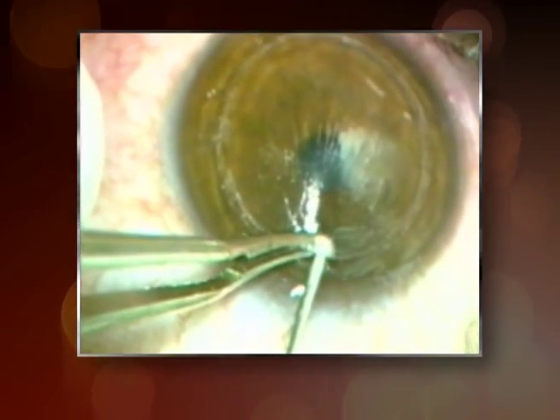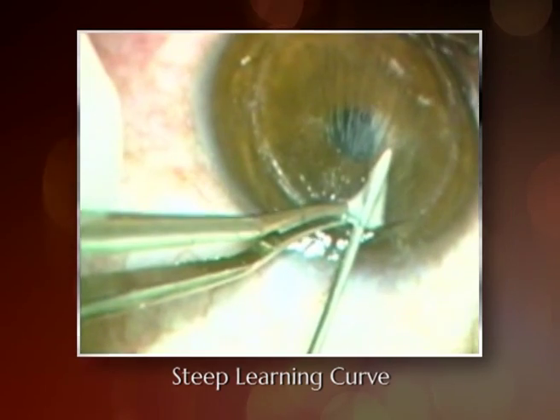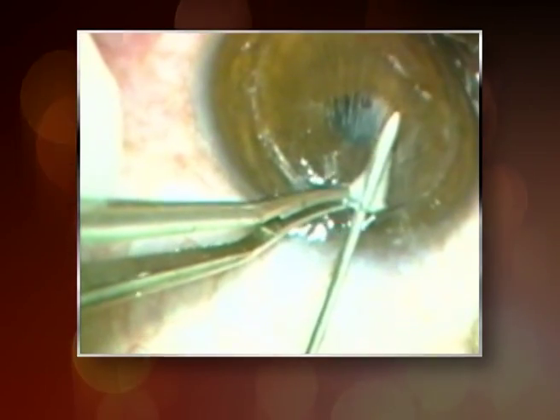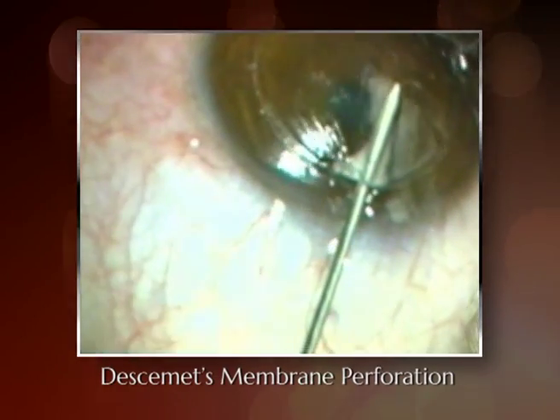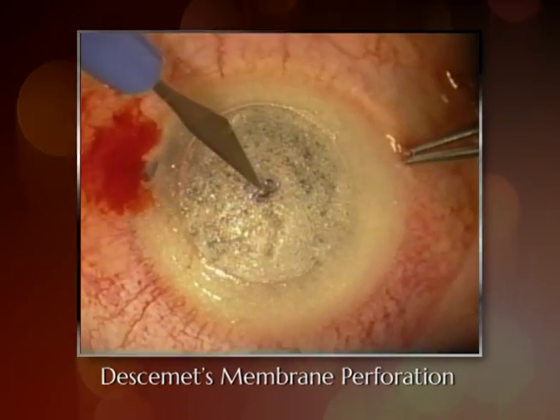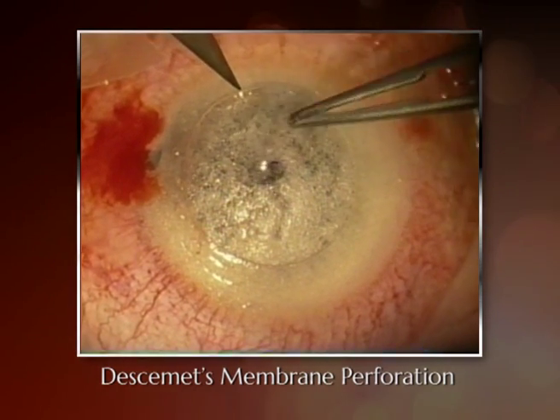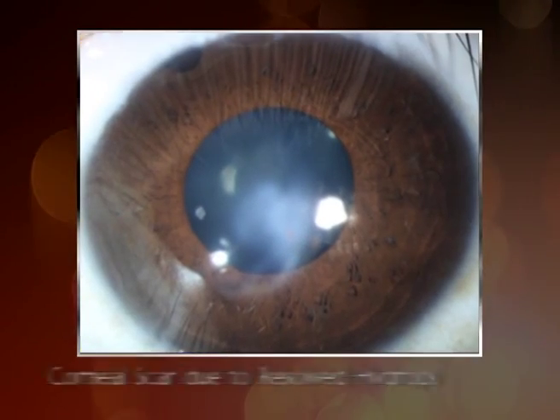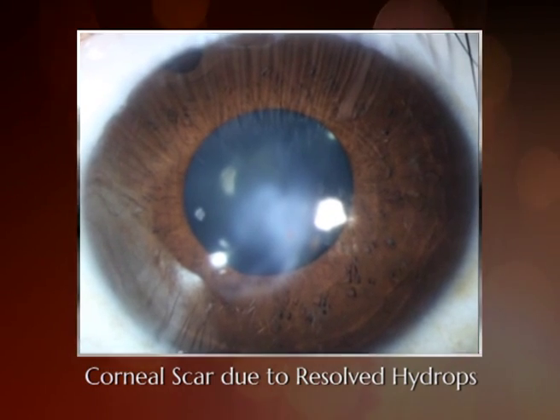The major limitations of the big bubble DALK are the following. It has a steep learning curve. There is a risk of intraoperative Descemet's membrane perforation ranging from 4 to 20%, which is higher in cases of advanced keratoconus and extreme corneal thinning. It is often difficult to perform this surgery in the presence of a corneal scar due to resolved hydrops.